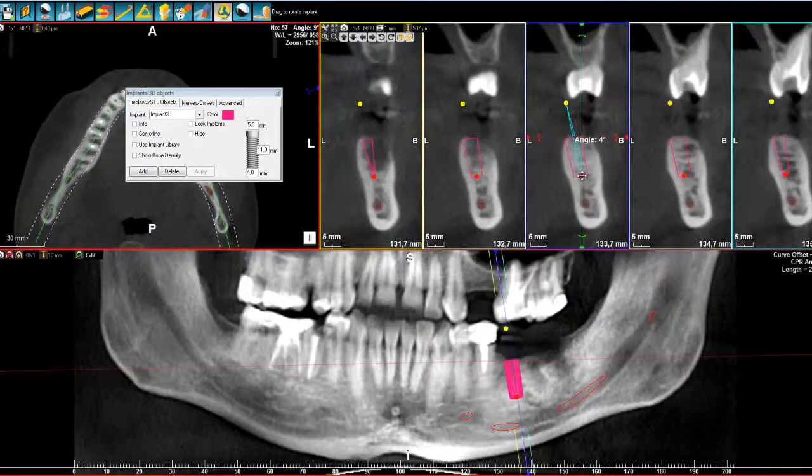So I can simply come here and change it. If I want to be more precise, I can apply. You can see that here the icons that used to be useful for the views are now dedicated for implants, and in my view I can simply turn degree by degree, or move them with close to below-millimeter precision. So like this I can get maximum precision for my implant.